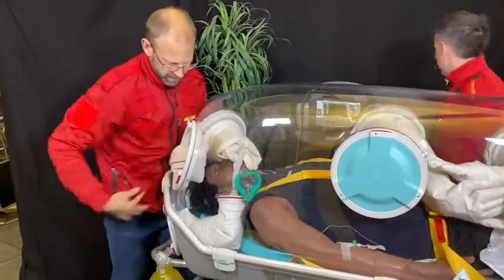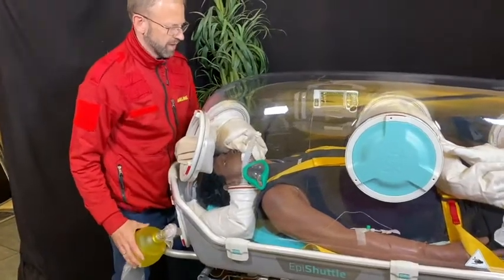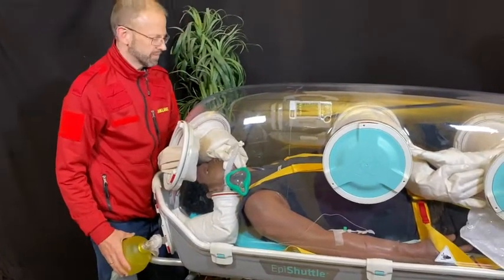And then we are back to ventilating through the tube. And now we can fixate the tube as we usually do.